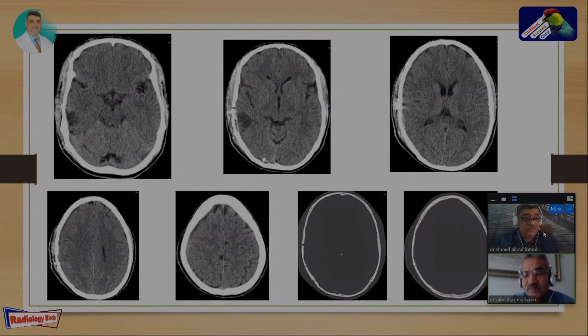تاخدنا ناحية الهيستوبلازموزس؟ الواقع اللي هو الدراج ابيوزز. طب علاقة الدراج ابيوزز بكده إيه؟ هل الاميونيتي؟ بالضبط، ولذلك وضعنا الجرانيلوما. أول ما شفت الحالة قلنا go away from carcinoma. إيه اللي خلاك تروح للجرانيلوما؟ الرينج انهانسمنت. الواقع الرينج انهانسمنت والريجولاريتي، عندنا main diagnosis ring enhancing lesion, especially when it's multiple, we have to think in metastasis or infection.